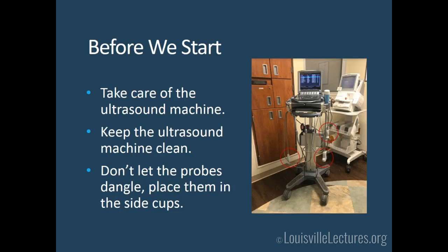Just some housekeeping: try to take care of the ultrasound. Don't let the probes dangle — those probes are very expensive. These machines help us a lot when we need them. When someone's crashing and burning, we get lots of valuable information from doing an ultrasound. We've got to protect these machines and keep them clean and well.